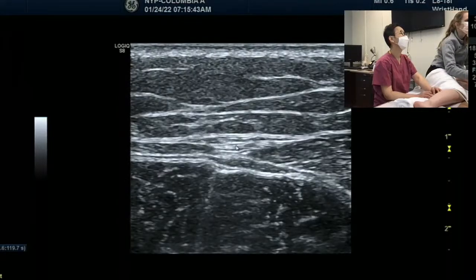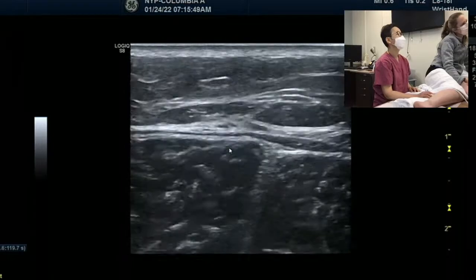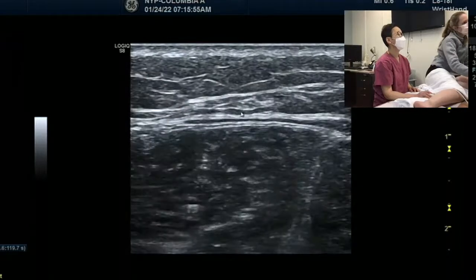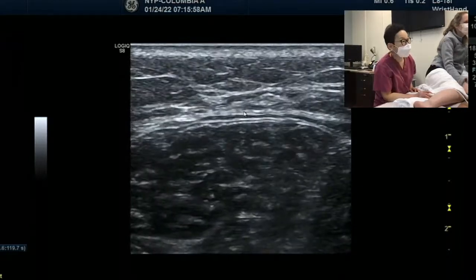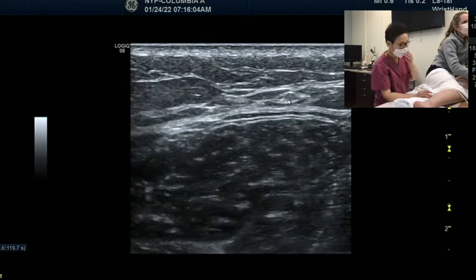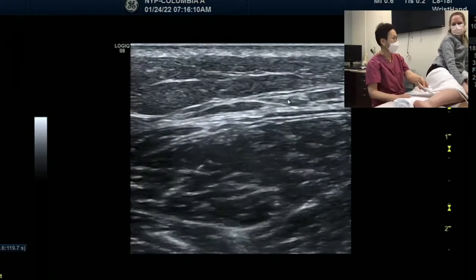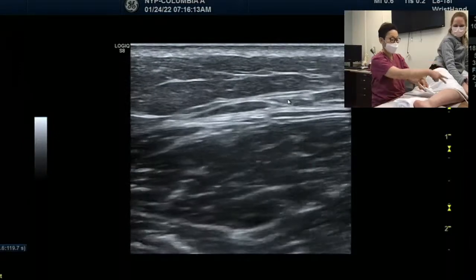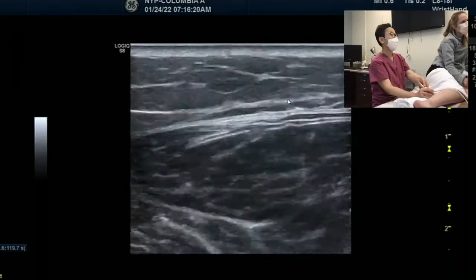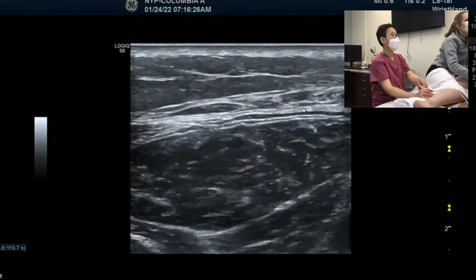Above. One, two. Dr. Kim, I don't tell a lie, but I follow, scroll down, see? They become the sural nerve. It's very clear now, see? I'm going down. If you are able to find that sural nerve very well, that means you're in the distal part, before they split. If you look at my leg, one third from the ankle to the knee, I came up approximately one third, right? And you can see the sural nerve in the adipose tissue over there.